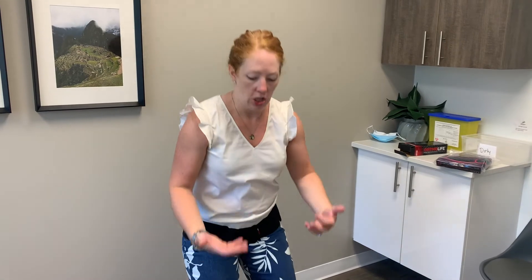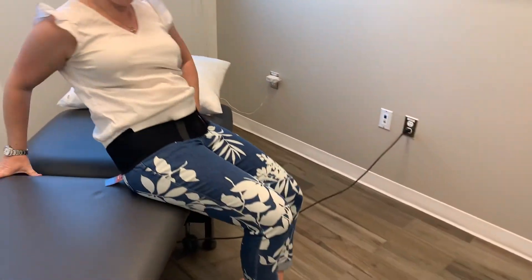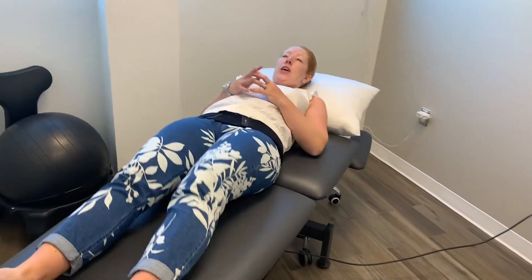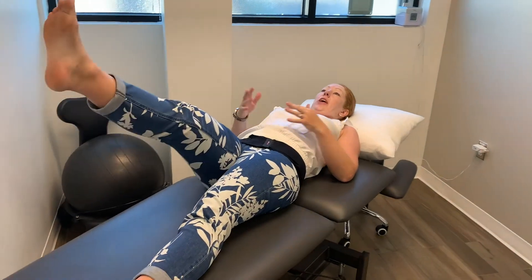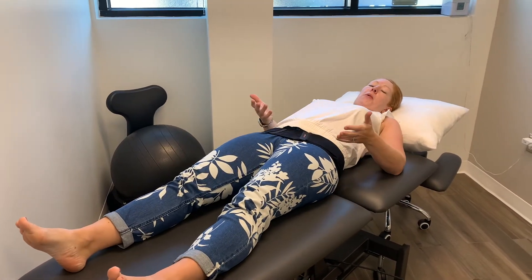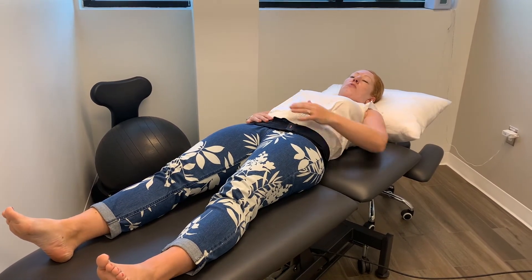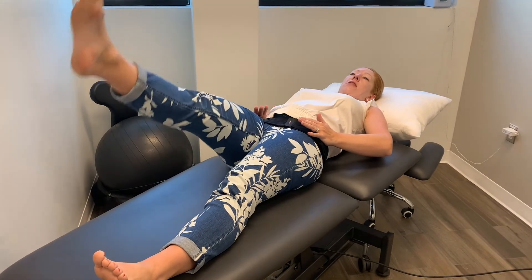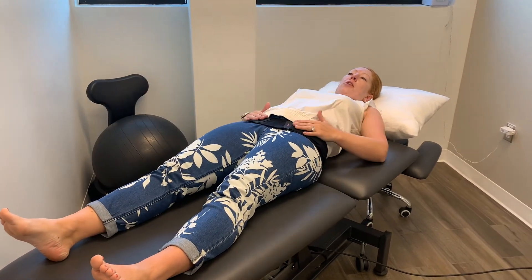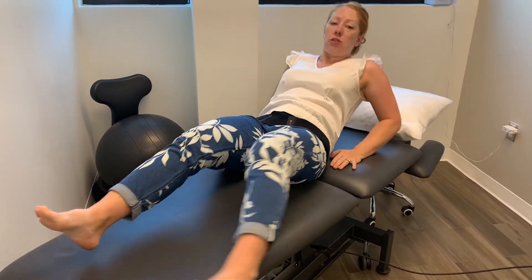When fitting someone with this belt, we'll typically have them squat, or lay on their back and lift their leg. For a lot of clients, when they're lying in bed and they lift their leg, their body contorts and they get back pain. If we then squeeze their hips together, or tell them to tighten their abdominals and they lift again without that teetering pelvis and without back pain, then we know we need to cue those muscles.